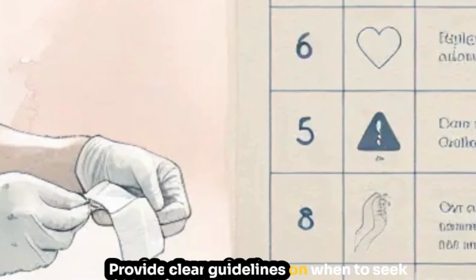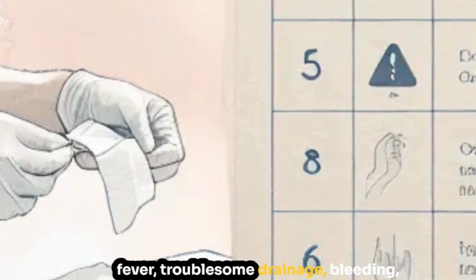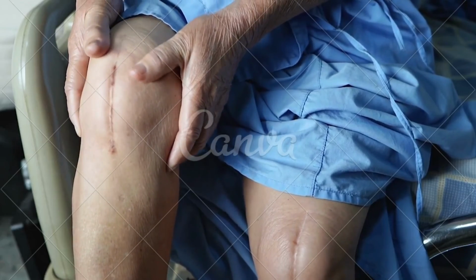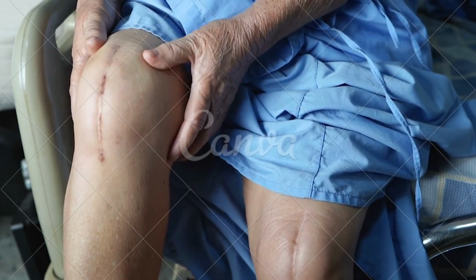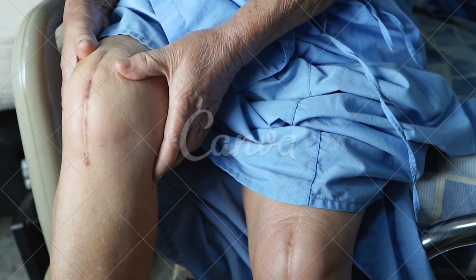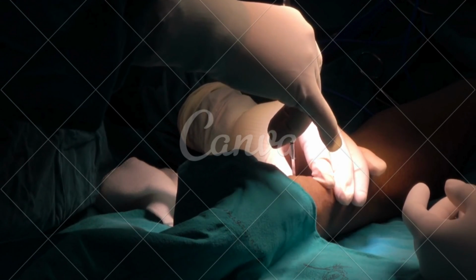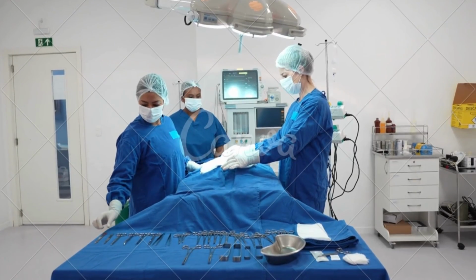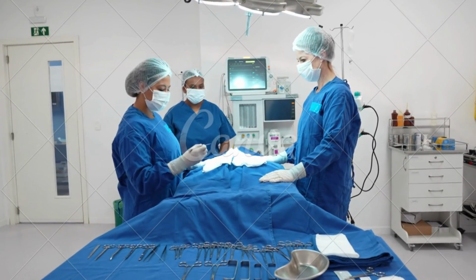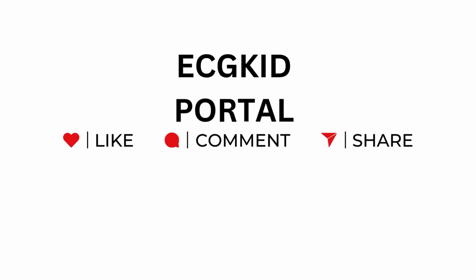Provide clear guidelines on when to seek medical help, such as increased pain, fever, troublesome drainage, bleeding, or a return of original symptoms. There are times when complications occur, like abscess recurrence, bleeding, persistent pain, infection spread, fistula formation, or scarring. Address these issues with additional antibiotics, further drainage procedures, or surgery if needed. Preventive measures include maintaining sterile technique, properly draining the abscess, and providing diligent post-procedure care.